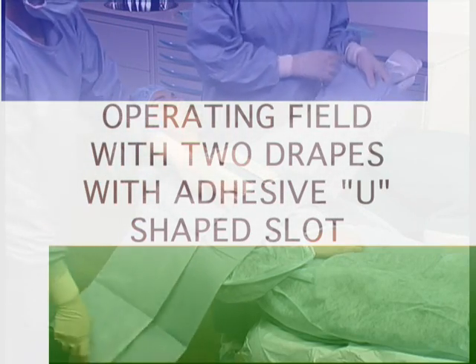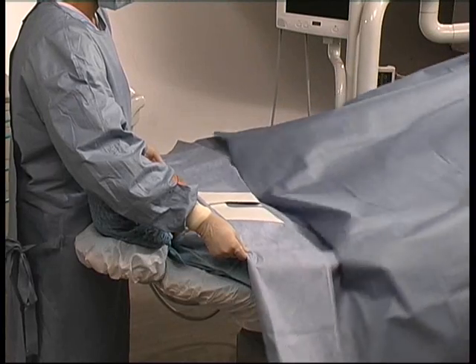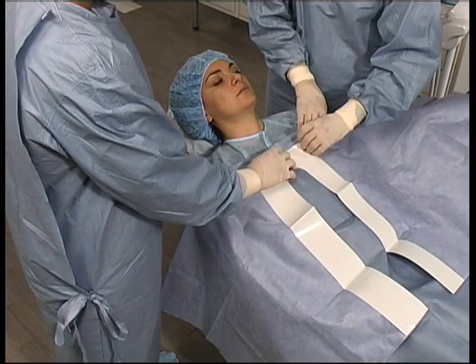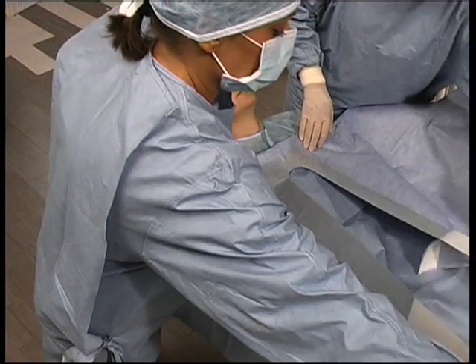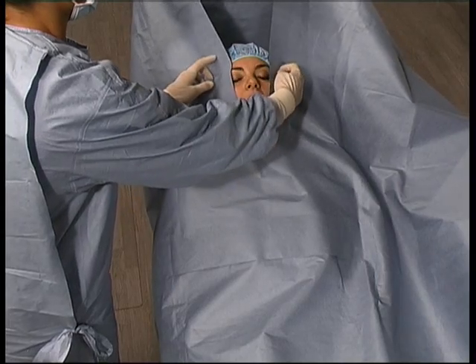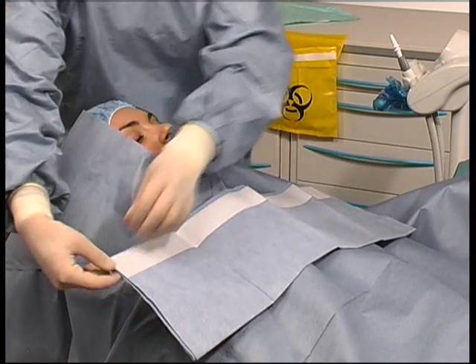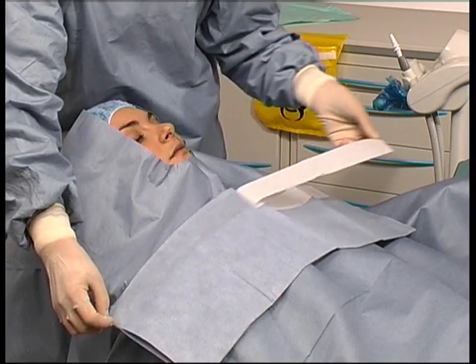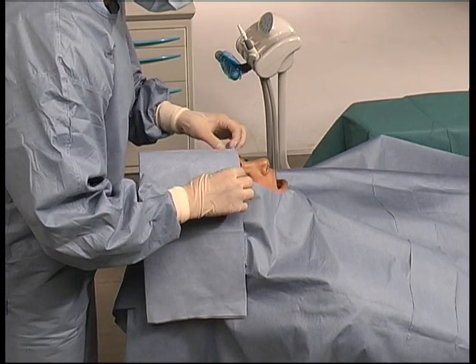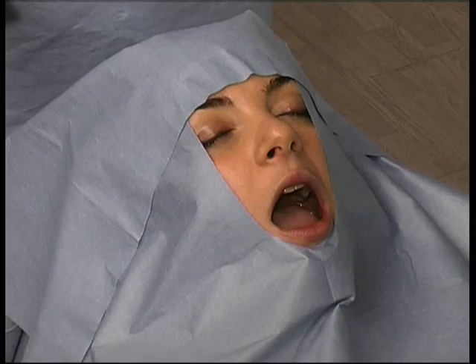Operating field with 2 drapes with adhesive U-shaped slot. The drape is placed over the patient's chest and unfolded towards his feet. Having removed the protective strips from the adhesive side, the drape is fixed along the patient's face and the adhesive tabs are joined at the back of the neck. The head drape is placed with the adhesive strip on the forehead and then unfolded backwards over the head. In this case, the patient's nose and eyes remain uncovered.